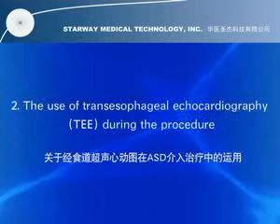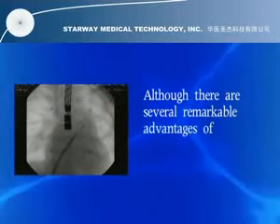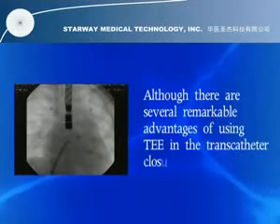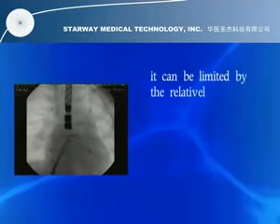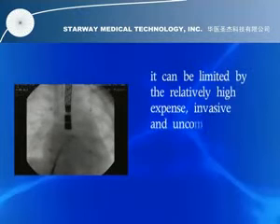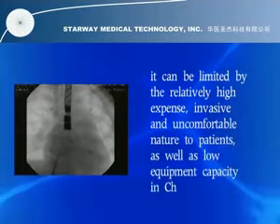The use of transesophageal echocardiography (TEE) during the procedure. Although there are several remarkable advantages of using TEE in the transcatheter closure of ASD, it can be limited by the relatively high expense, the invasive and uncomfortable nature to patients, as well as low equipment capacity in China.